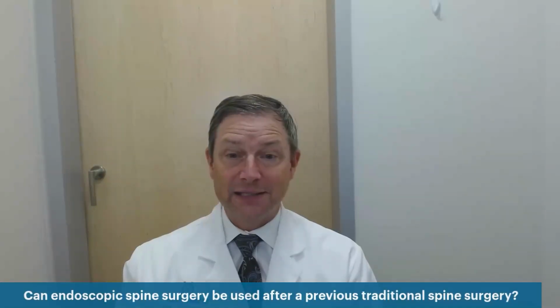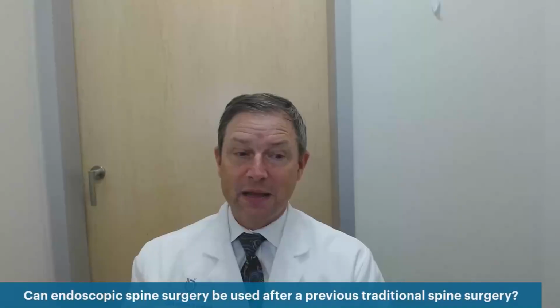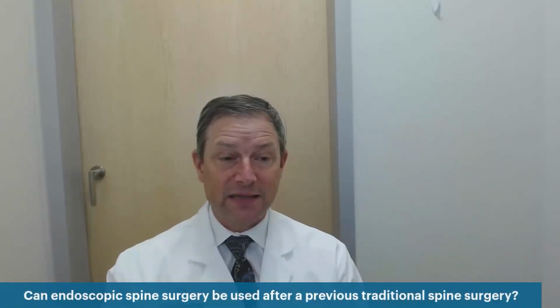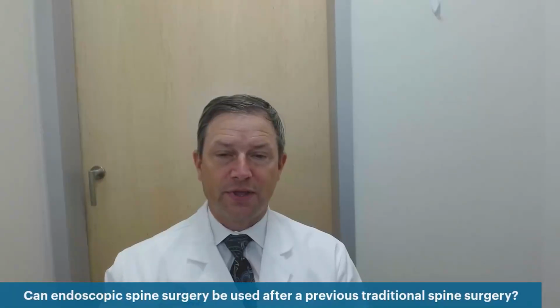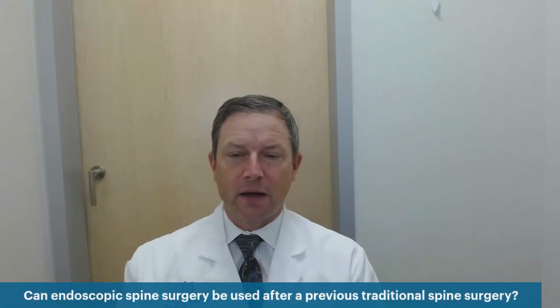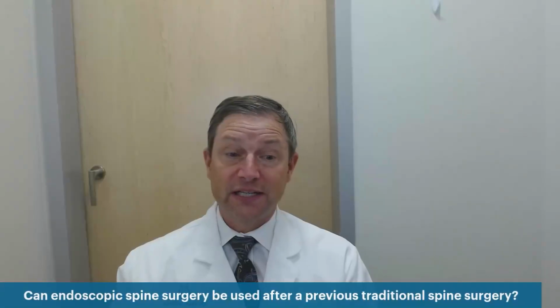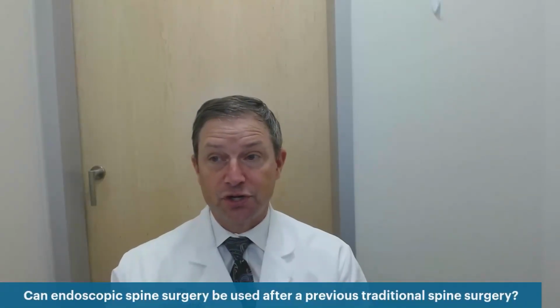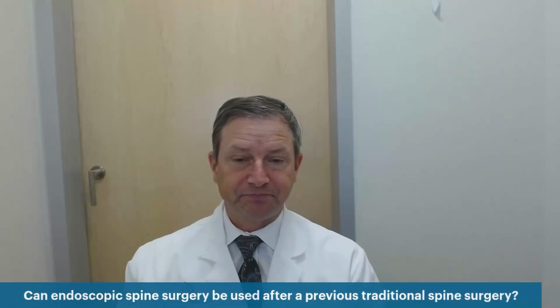I think that the endoscopic spine tools are very good at differentiating those and being able to very slickly get in there without creating a lot more scar with an open procedure, and safely differentiate between the scar and the recurrent disc and the nerve roots, which is what you want to do. So I do love to use it in some revision type surgeries, yes.